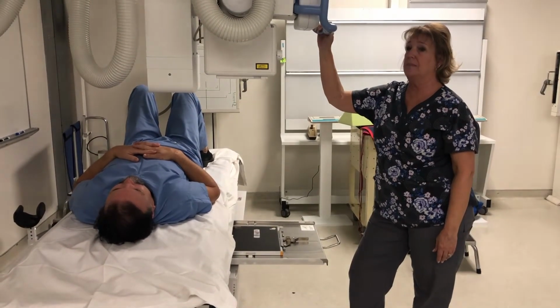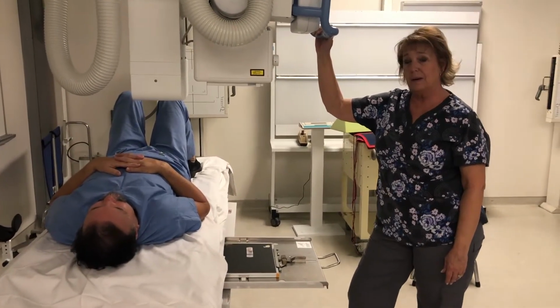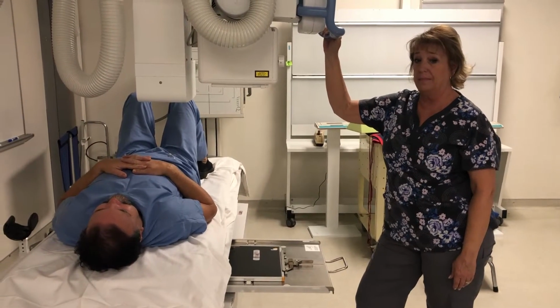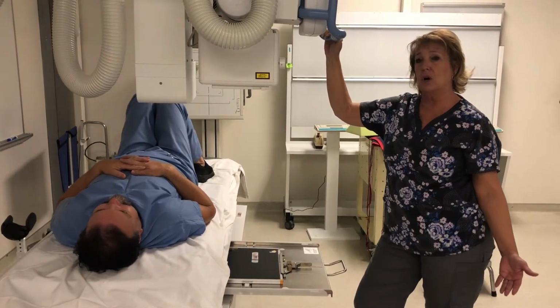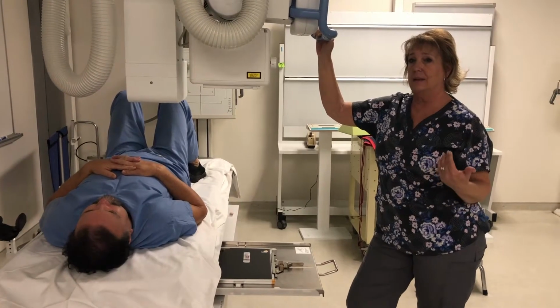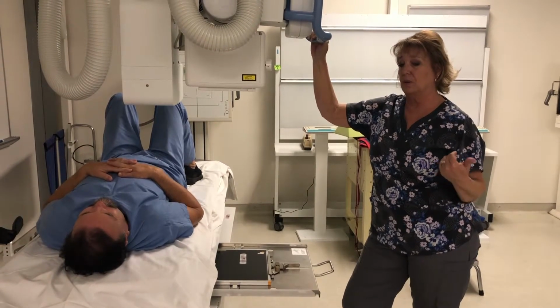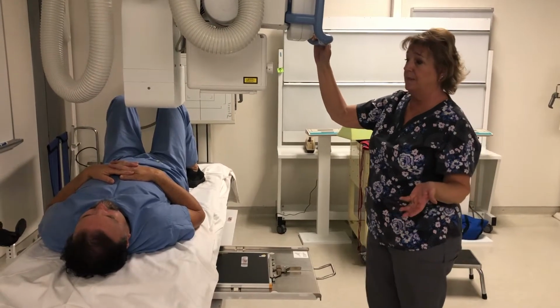Since CT has become so popular, you're not going to do as much spine work as I did when I was growing up as a tech, but we still do quite a bit of it. I would say for trauma, it's almost all converted to CT, but for arthritis and other abnormalities, non-traumatic injuries or chronic type things, we still can be asked to do quite a bit of spine imaging.